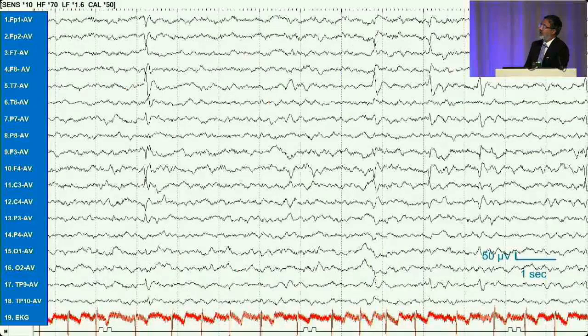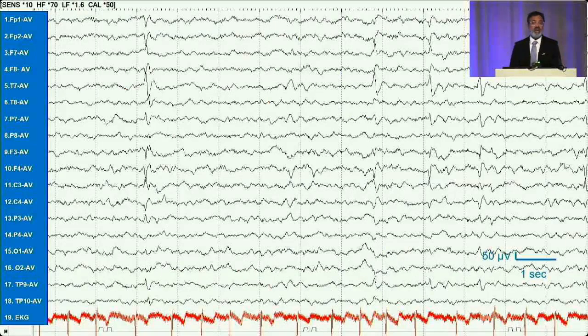Okay. So the common average montage is a way in which you can compare. The second electrode is a mathematical sum of all the electrodes that are present, averaged and divided by that number. So say you had 25 electrodes and you wanted to get a common average montage. You take all the information from the 25 electrodes divided by 25. So that average electrode will give you a smearing effect. It prevents having one electrode overvaluing or having more impact on that second electrode number.